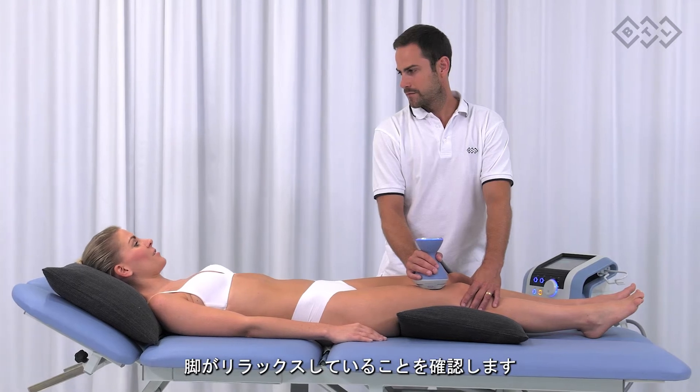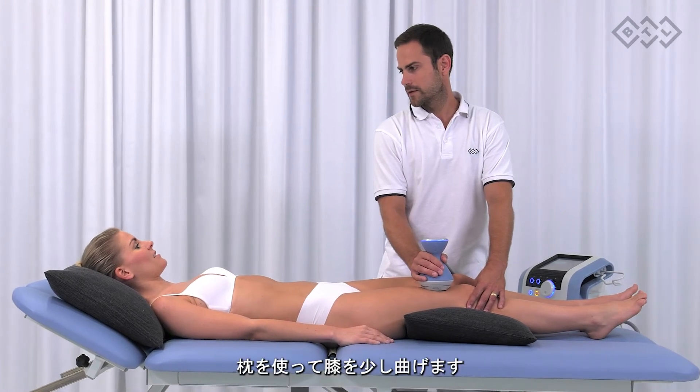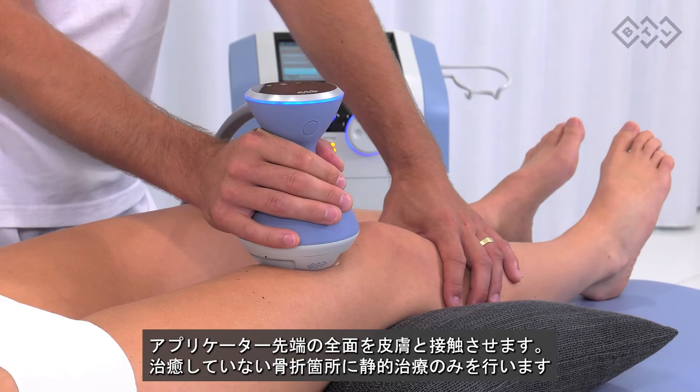Femoral nonunion. The legs should be in a relaxed position. Use the pillow to slightly bend the knees. Apply full contact therapy and perform only static application in the place of the unhealed fracture.